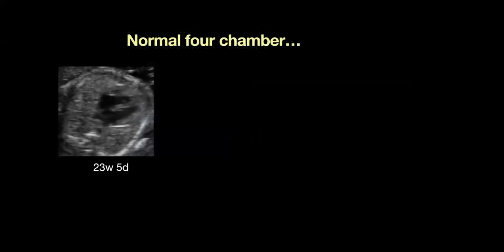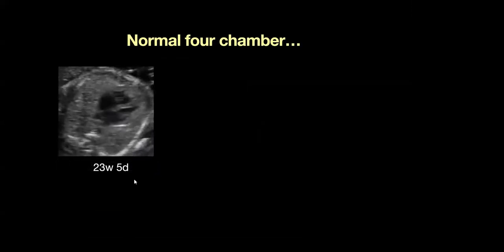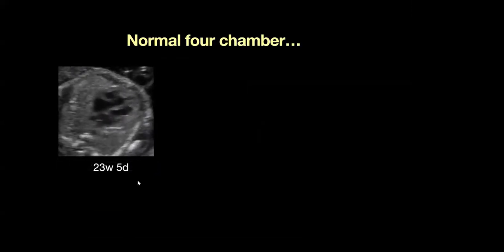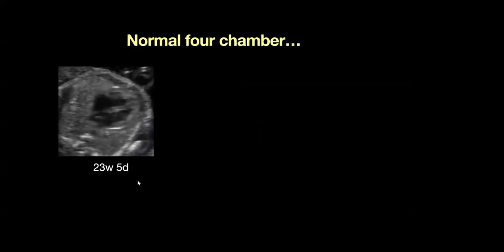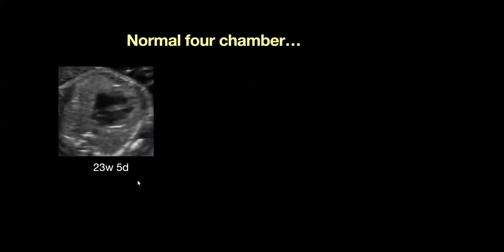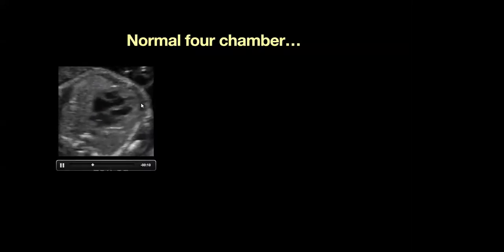And here's just an example of another case. And I know I love to show a lot of old clips, but not many people have new machines. So this is the prime example I'd like to show. So here's a fetus, four chamber, came in for anatomy scan. I just wanted to show that this is a four chamber that we did see, 23 weeks and 5 days, and we cleared it. And then here we could see that there's a normal, obviously interventricular septum.